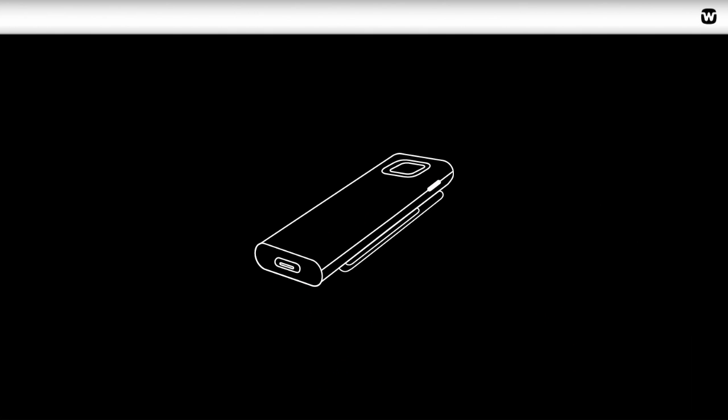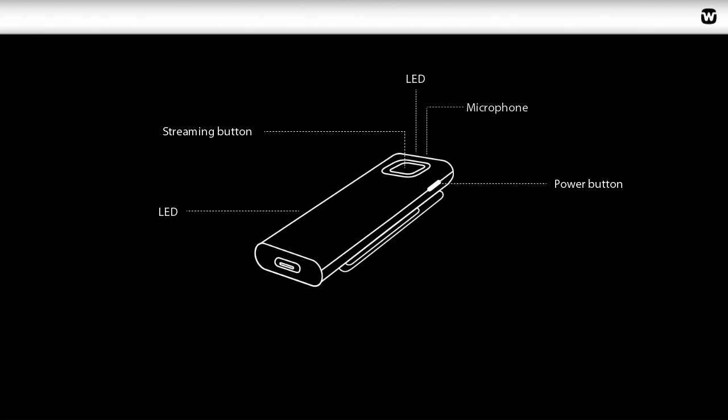The Remote Mic features a streaming button, power button, LED indication at the top and side, microphone, micro USB port, and a clip for easy attachment to clothing.